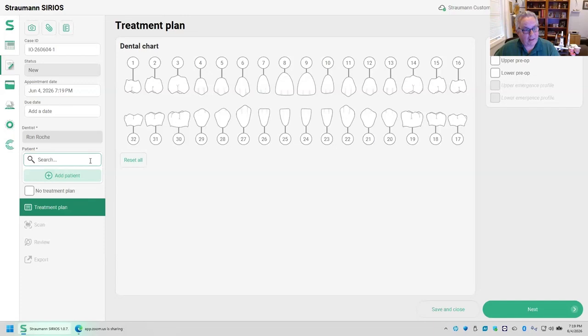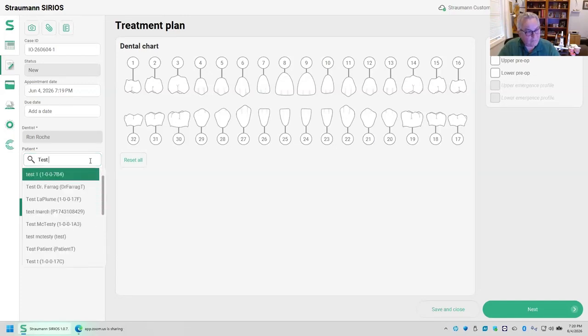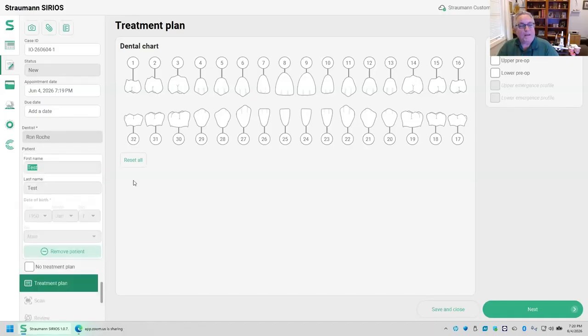I do need to give it a name. So I have a patient, my favorite patient named Test, actually all of his siblings here. Okay, all right, we'll select him. All right, perfect. So I now need to set up my lab script. Well, I don't need to, but I do prefer to set up a lab script.